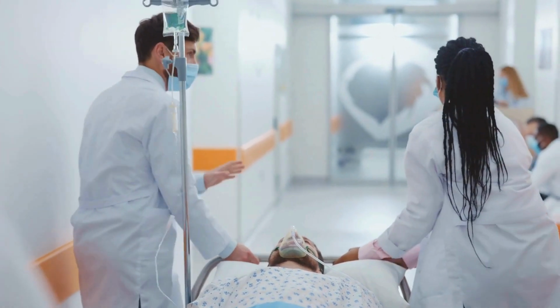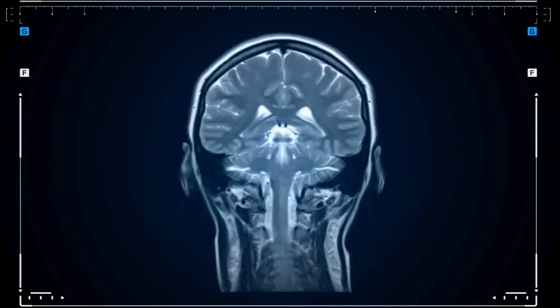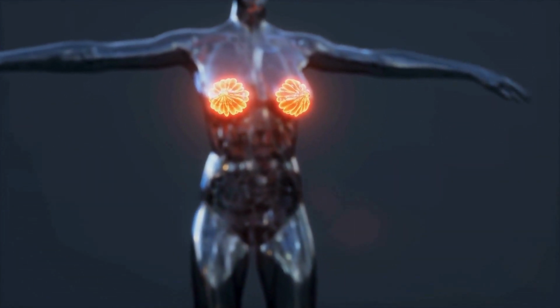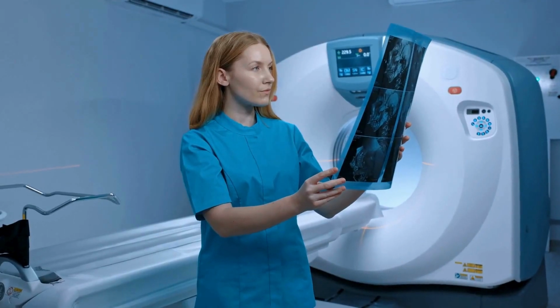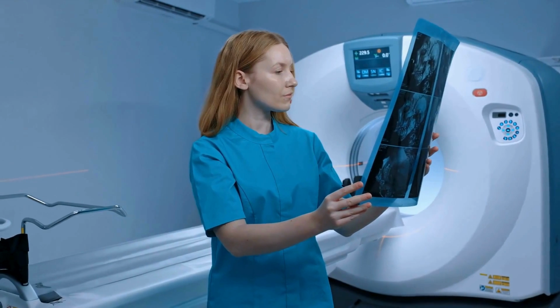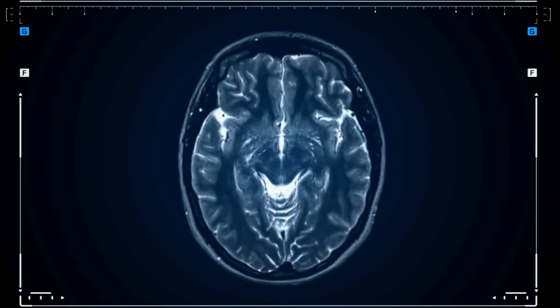in MRI images. Additionally, the operator can adjust the scan's parameters, like the length of the pulses, the intervals between them, or the angle at which they're applied. This lets them tune the contrast between different tissue types and tailor the scan for specific purposes, such as detecting tumors, inflammation, or nerve damage.